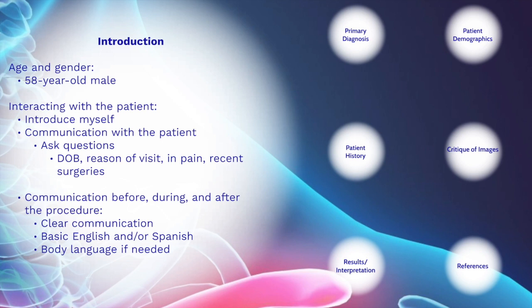In order to confirm that I have the right patient, that I will be performing all the exams he came for, that I do not cause any more pain than what he has, and allowing me to be aware if I find any artifacts in the radiographic images. My communication before, during, and after with the patient will go just like this.